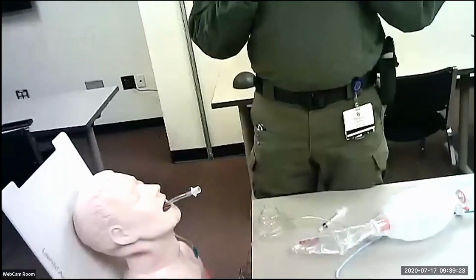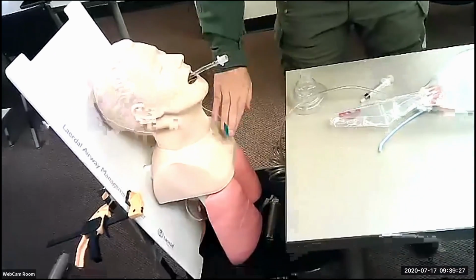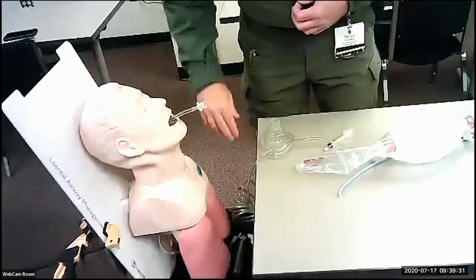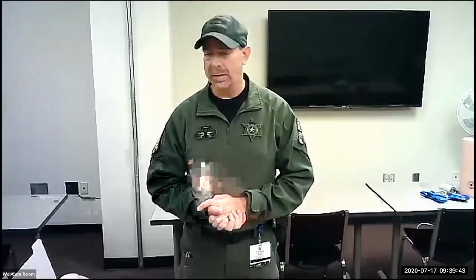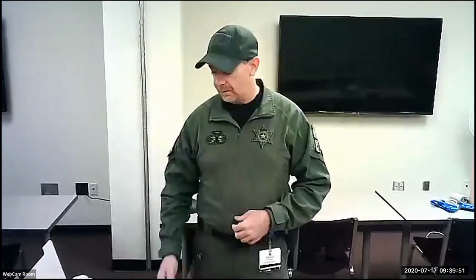The other thing is we're going to auscultate. We're going to listen. So when we listen to both lungs, all right, and the stomach, you're going to go down and listen actually to the stomach area. So both lungs and stomach, you hear gurgling inside your stomach if it's in the wrong place, if it's in your esophagus. We call it tubing the goose. If you tube the goose, it's no bueno, all right? There's many people out there who swear they got them intubated. I know it was in the right place. No, they're in the stomach. That won't save a life.